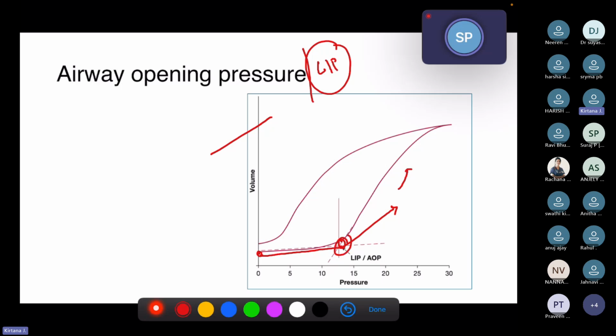Remember, these curves can only be plotted at extremely low flow states. We get similar curves for our patients who are on ventilators who are getting high flow. Under high flow, these curves cannot be used to predict your lower inflection points. They will not be a true estimate.